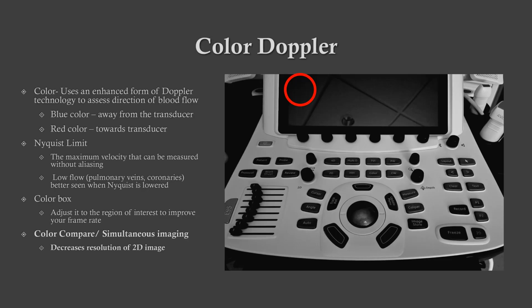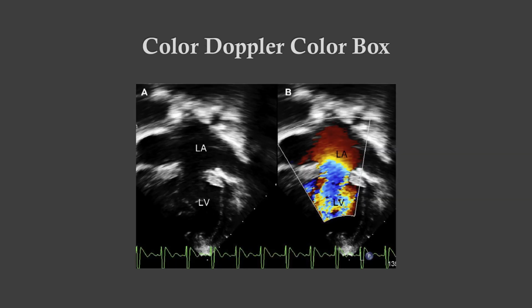Color compare or simultaneous images can be used but not abused. Be mindful of how often you use it and know that it decreases resolution of the 2D images. Here we have an example of color compare or simultaneous images.